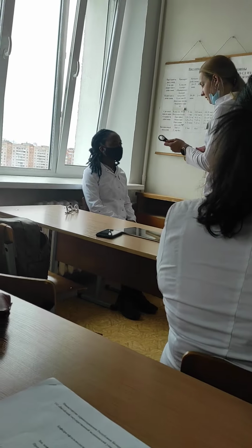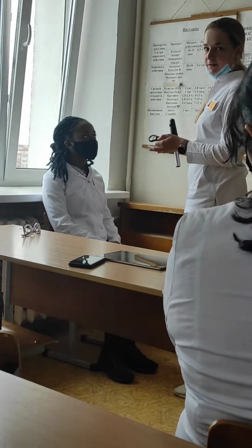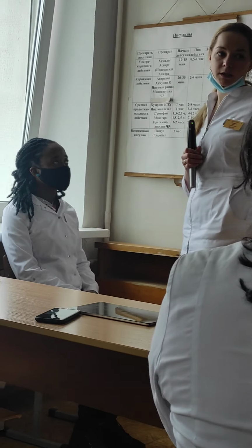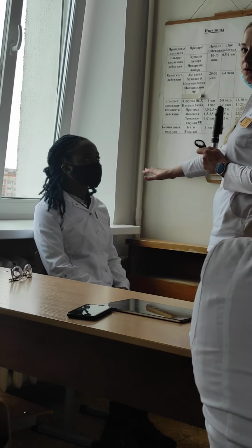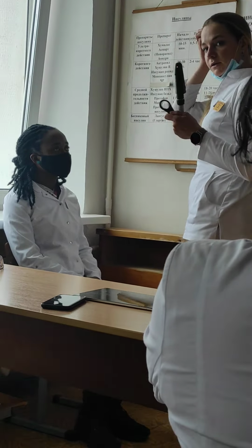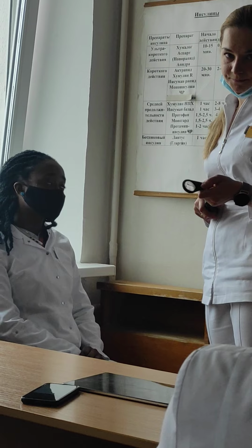To do this examination, we have to put the patient in a sitting position, and the source of the light, if we're doing it with the mirror ophthalmoscope, should be on the left of the patient, so the left shoulder next to the source of the light. By using the electronic ophthalmoscope, we are just standing in front of the patient. And first we need to see the optic nerve disc head.